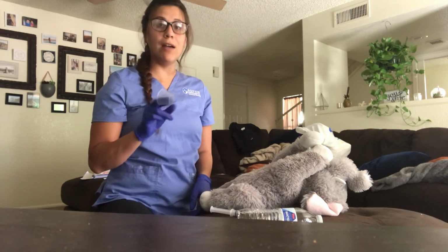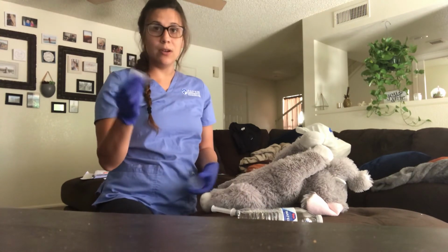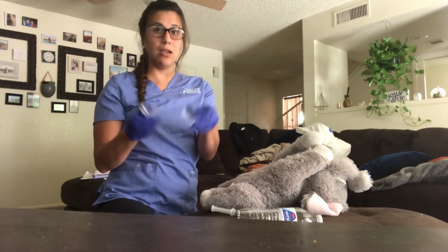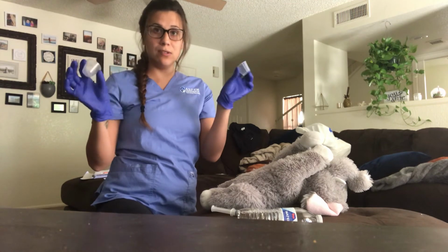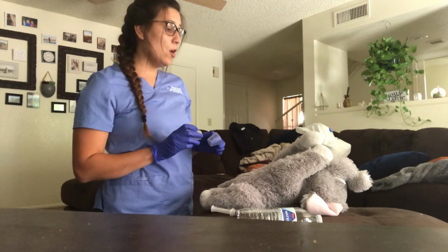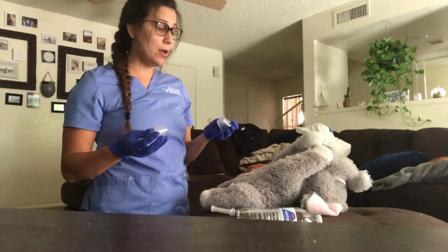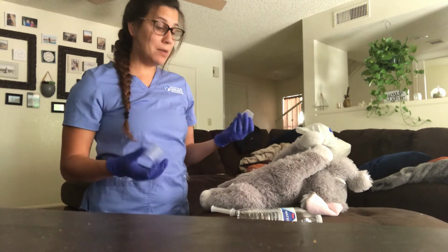You never, ever, ever mix the medication. So if you have one medication, you put it in here. If you have another medication, you put it in here. They each get their own cup, their own sterile water. Don't ever mix them. So then you could start administering medication.